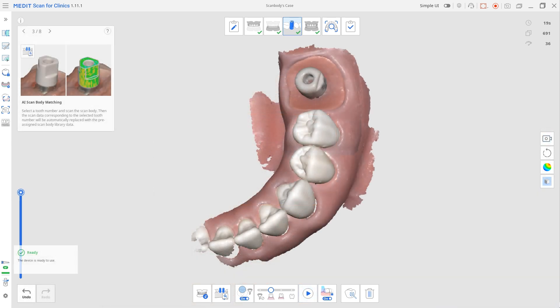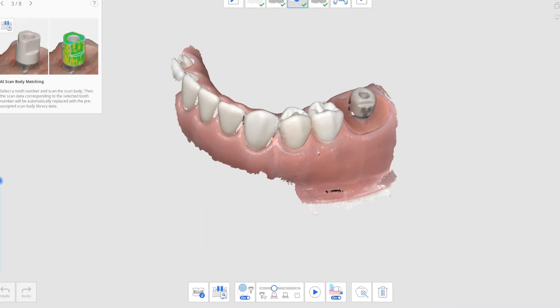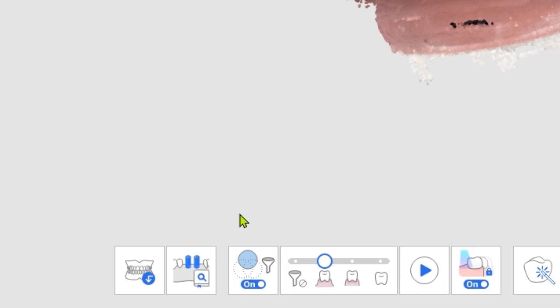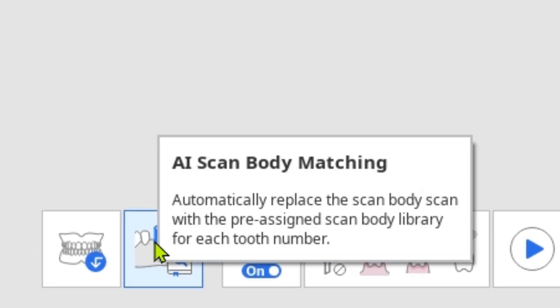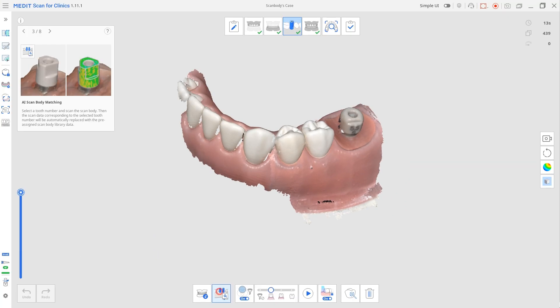Now we are going to use AI matching. AI scan body matching is useful when cases are hard to scan, such as with a narrow implant area or metal scan body materials. The location and angulation of the implant can be accurately reproduced by scanning and overlapping it from the scan body library. Click AI matching from the bottom.